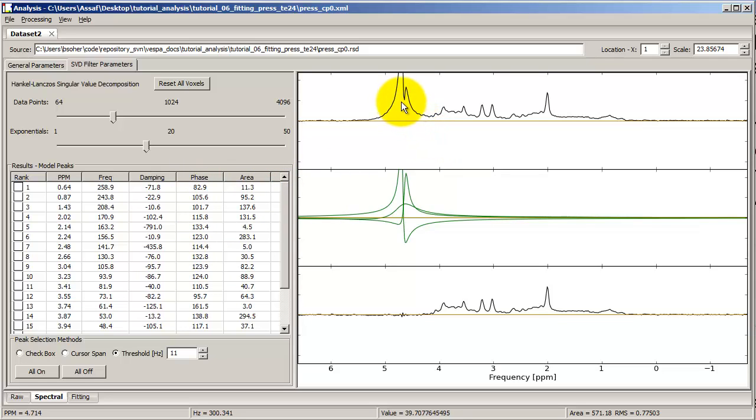Now, just counting, we can sort of guess that we'll have one Lorentzian representing the NAA, another one for the creatine, for the choline, for the second creatine peak at 3.9, and then for the myo-inositol, and maybe it looks like we're going to need maybe 2 or 3 Lorentzian peaks for the water. So they slowly add up, but just visually inspecting the spectrum, it looks like we can get away with 20.